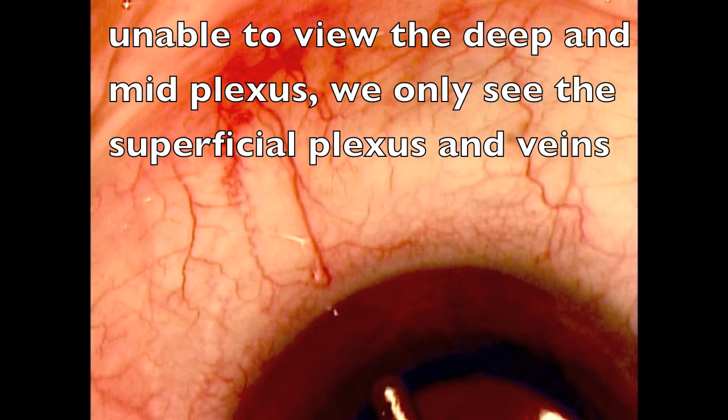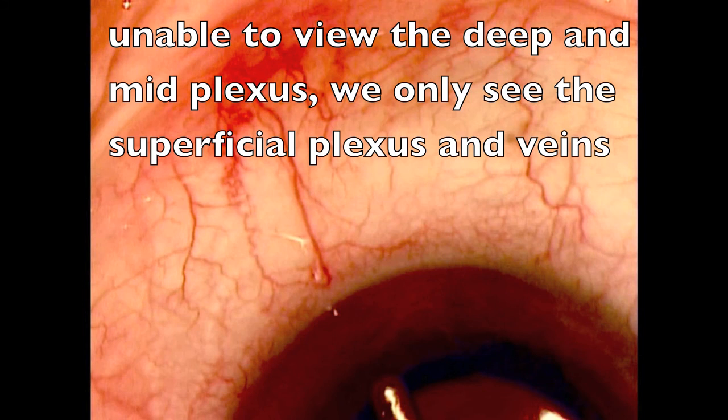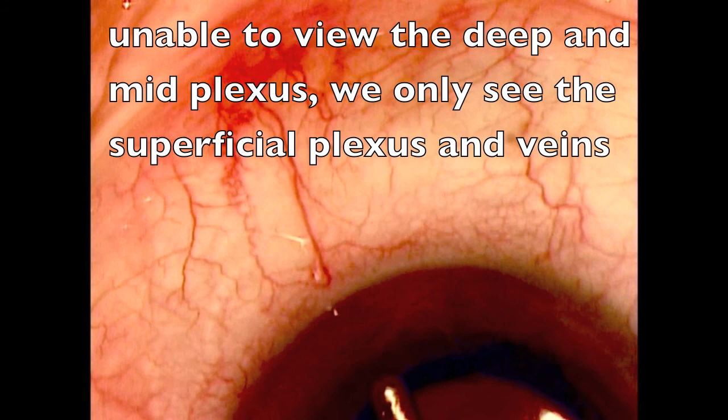However, to observe a wave, aqueous must pass through both the hidden deep and mid-plexi, thus demonstrating their patency.